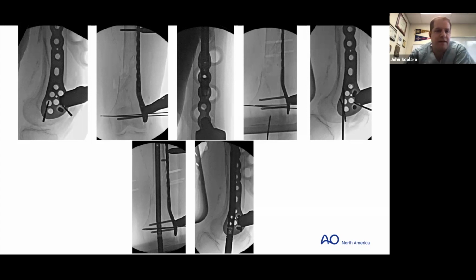And then once I had fixation distally, and you can see the sequence here of making sure that I had fixation distally outside of the path of where my intramedullary nail would go, unicortical fixation proximally to keep everything lined up. And then it's just length, alignment, rotation and giving something that this patient can walk on right away. And so once the plate is on and things are dialed in, then standard nailing technique, which is essentially at this point just sawbones, and then trying to figure out length of the nail, and then placing the nail, and then just filling in as much as I can.